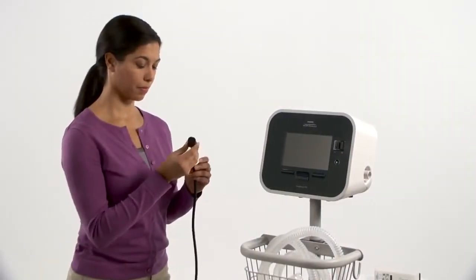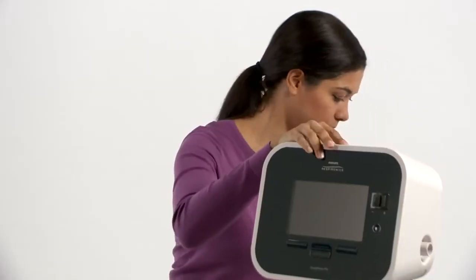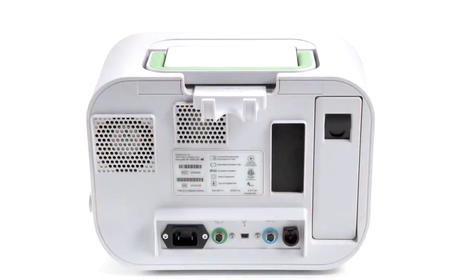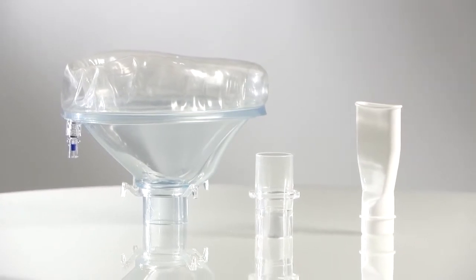To power the device, press the power cord firmly into the back of the device and plug the other end into an AC outlet. If you prefer, you can attach the optional lithium-ion battery into the detachable battery slot on the back of the device. A DC power adapter can also be used to connect to an external power source, such as a car battery. CoughAssist E70 can be used with a mask, tracheostomy tube, or mouthpiece.